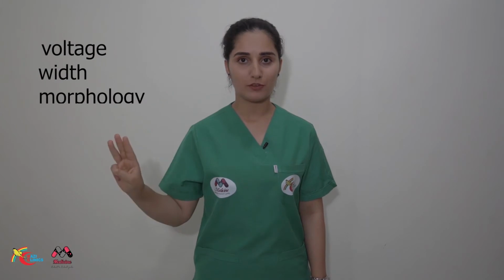The next thing to look at is the QRS complex. When looking at the QRS complex, you should look at 3 things: the voltage, the width, and the morphology. So first, the voltage. The normal voltage of the QRS complex is 5 millimeters in the limb leads and 10 millimeters in the chest leads. If this voltage is more than normal, then suspect ventricular hypertrophy.